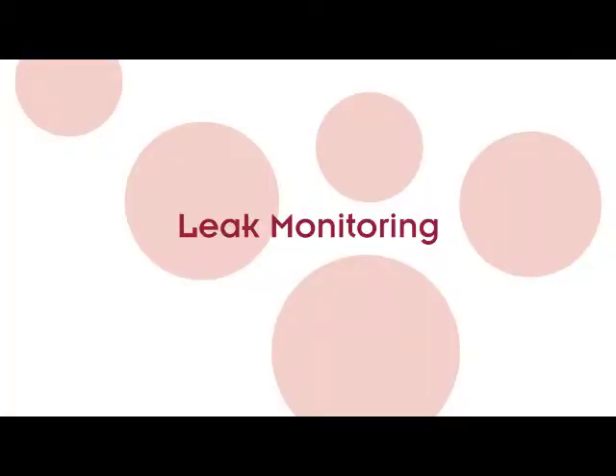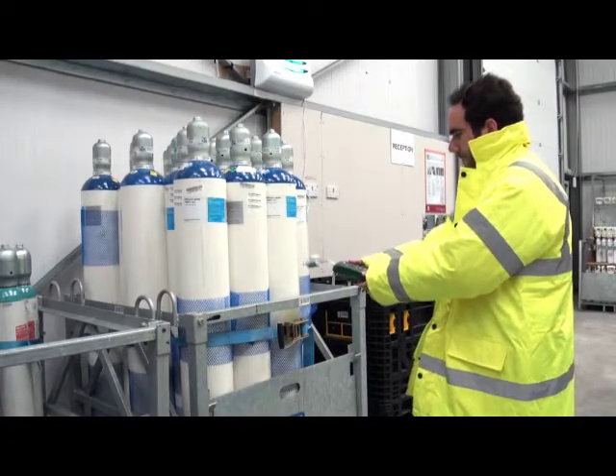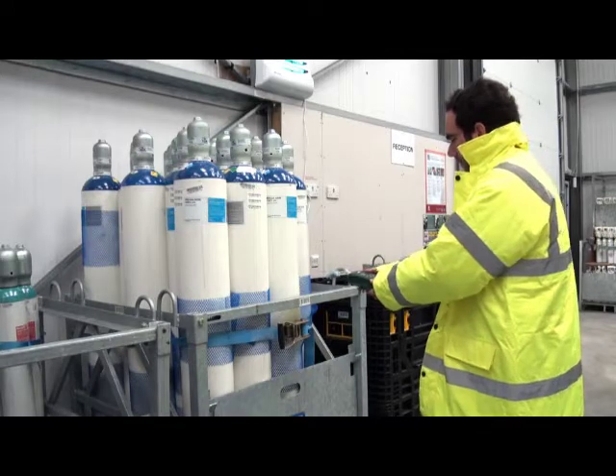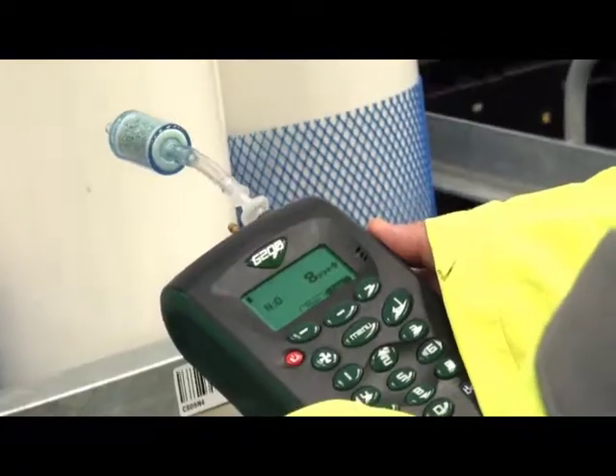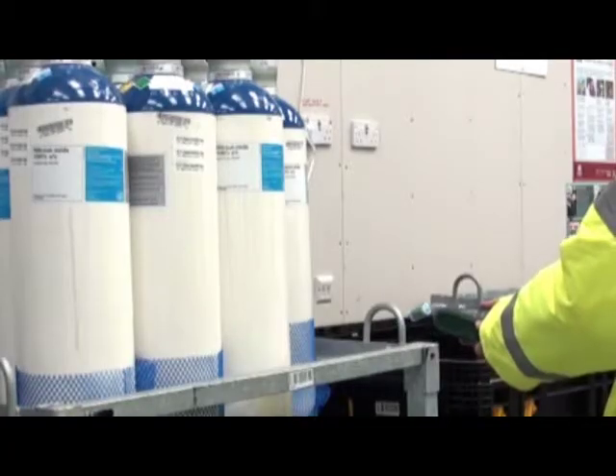Leak detection. The G200 also has a leak detection mode. The monitor is used near N2O canisters to ensure there is no leakage.